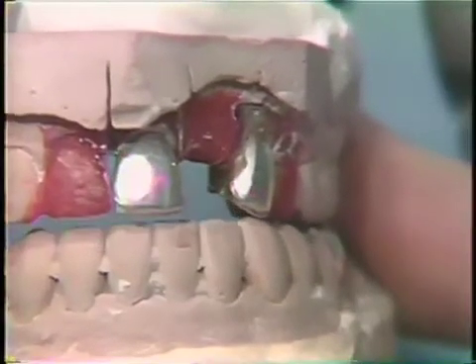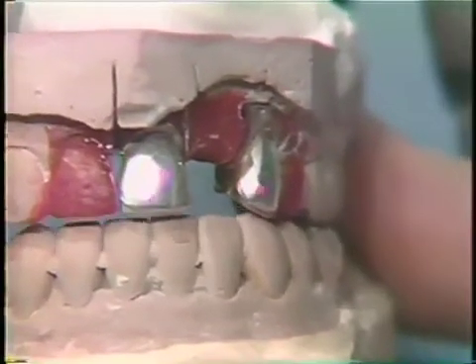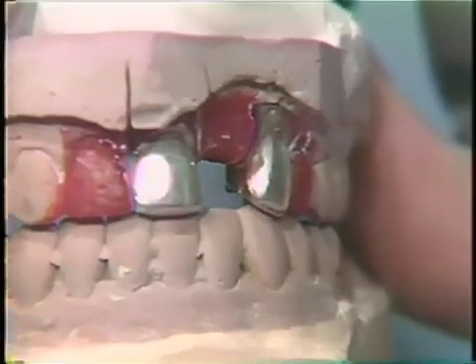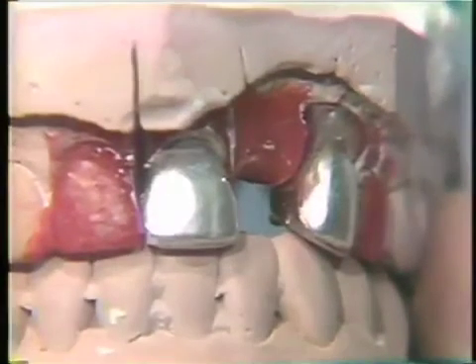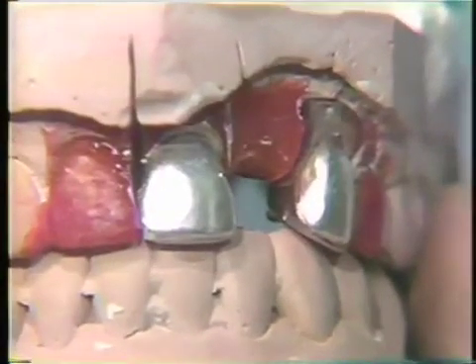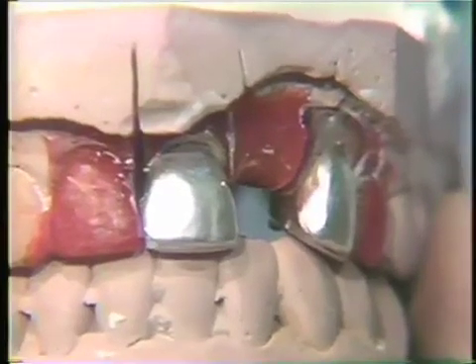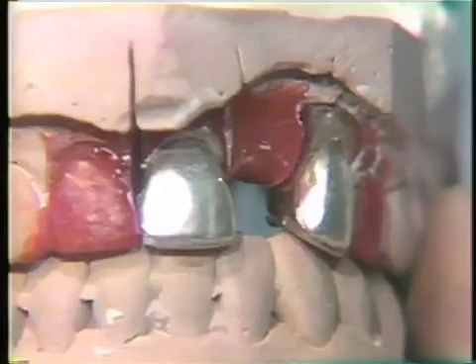Working is also checked. There should be no working interference, and there should be a cuspid guidance. If this is not correct, it should be changed at this particular time. The individual soldering lugs are refined, and now we are ready to wax the pontic for the fabrication of this anterior bridge.